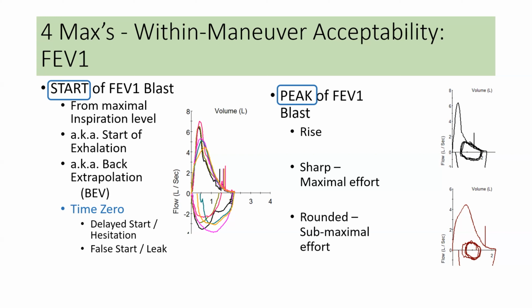The ability to overlay a series of flow volume graphs registered at the inspiration can help in detecting submaximal efforts that need to be discarded, and can also help in evaluating repeatability in a visual way.